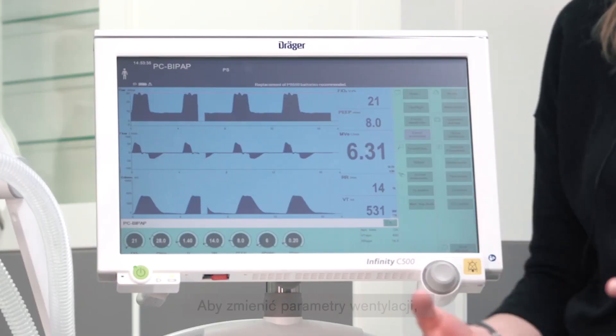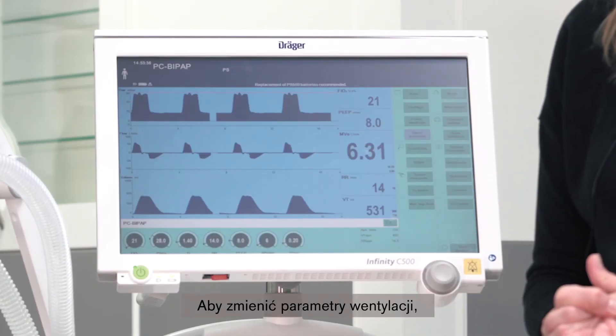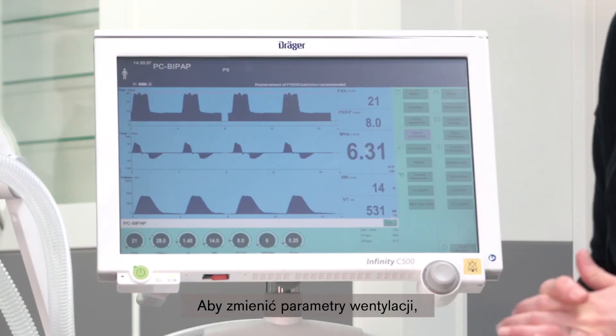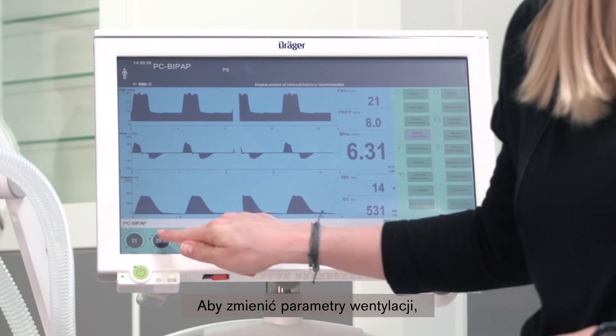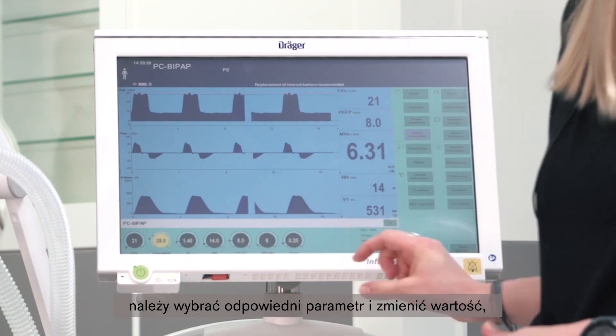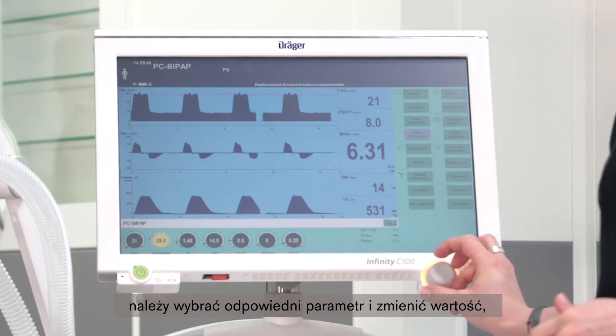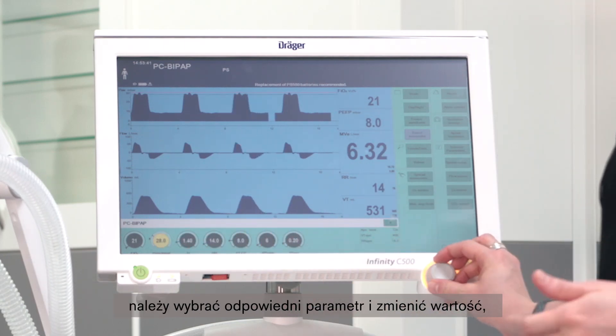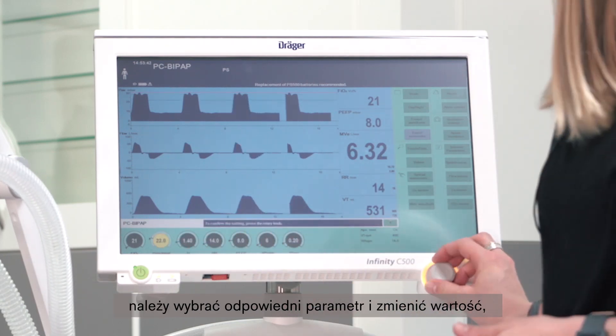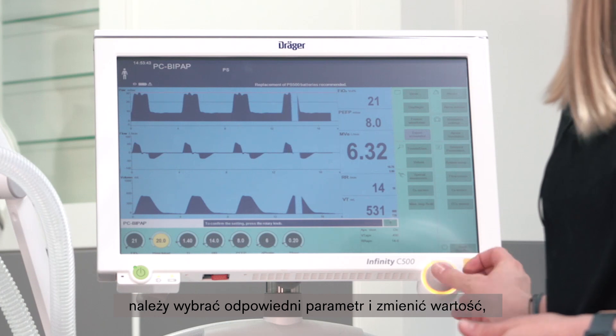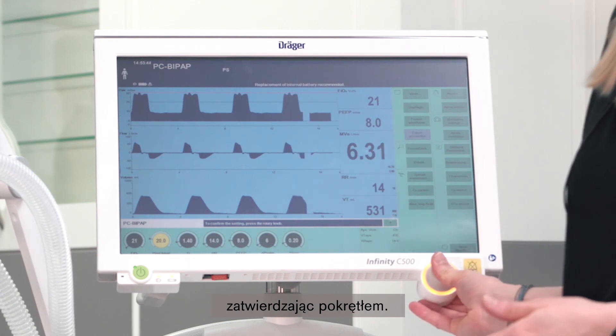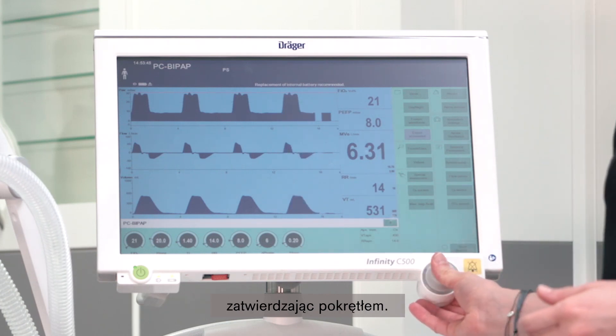To apply changes to your ventilation parameters, select the respective parameter, adjust it to the desired value, and confirm by pressing the rotary knob.